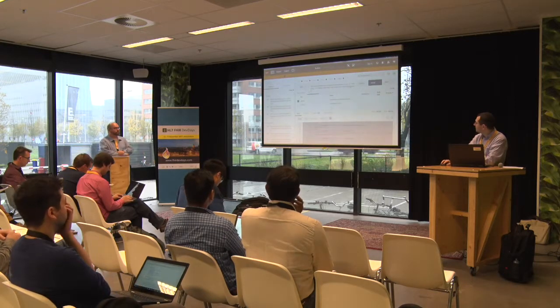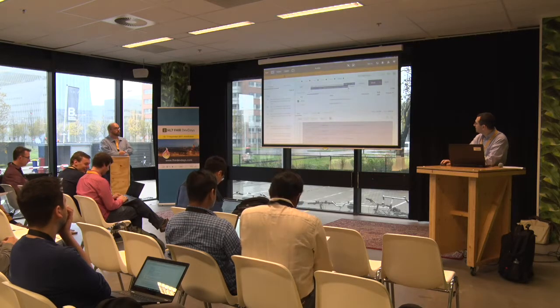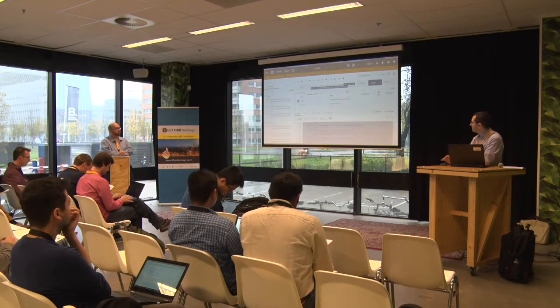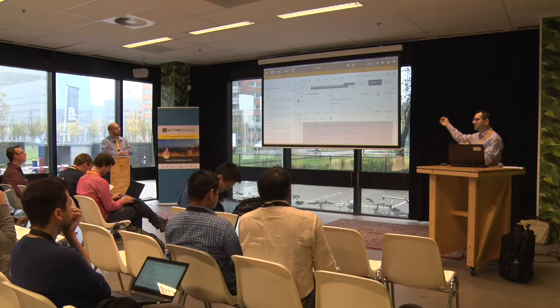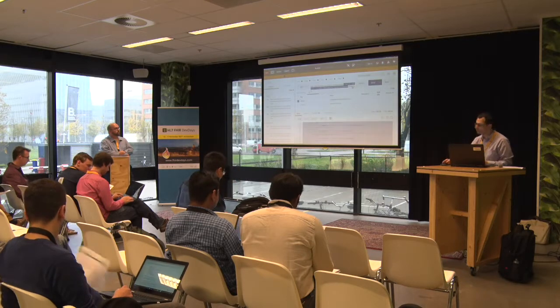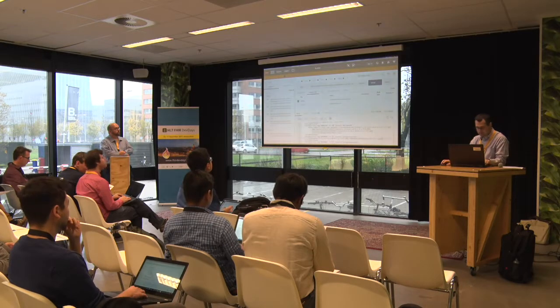So once again, the structure here is relatively simple. Brad mentioned the unique identifiers. They are very long, but that's the reason why, because they're unique. You need something that can be guaranteed to be unique. So in this case, I have the identifier for my study. You could use accession number to discover this identifier, but this is the unique identifier. This is the ultimate choice. That's what you want to use to be really sure. And then if I click send, then this actually here will return. I'll copy it to Notepad++.